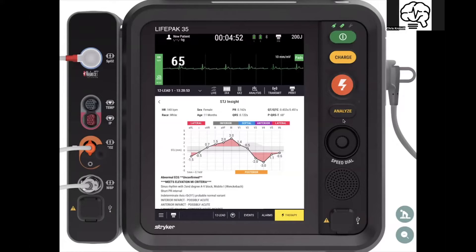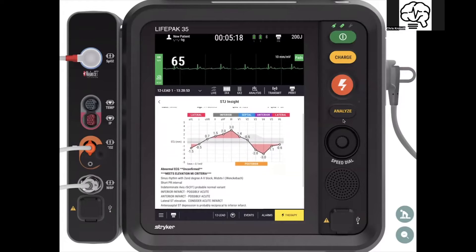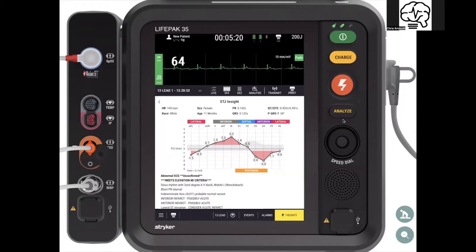What you see with STJ Insight is it's mapped out — it's almost like a heat map. The gray areas represent the normal variation you can have based on the ILCOR guidelines. You have your elevations in red as well as your depressions in red, and you get the same interpretive statement — in this instance, it meets ST elevation MI criteria. So this is a STEMI patient.